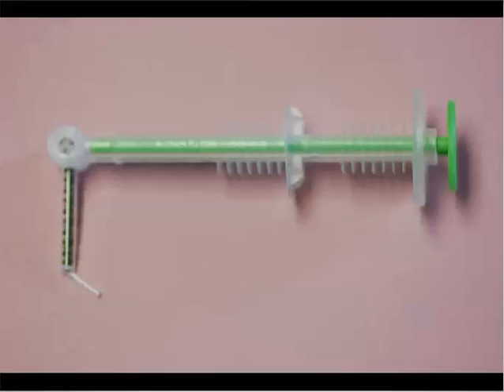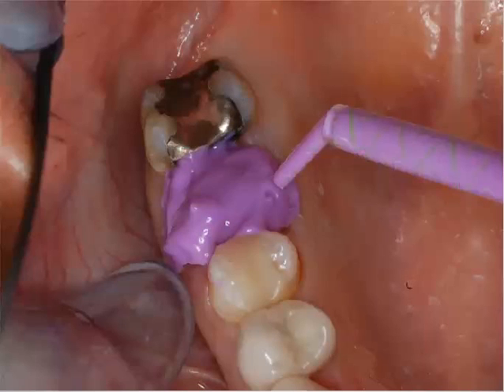You reinsert the plungers, and then this is mixed in this small little portion. So you save a lot of material. And this is cocked about a 45-degree angle. You have this small little orifice that you now can go ahead and get that tip right into the sulcus. As I mentioned, we'll show that more graphically as we go along. But once you get that tissue distended and the sulcus open, it's just inviting, waiting for that material to be injected.